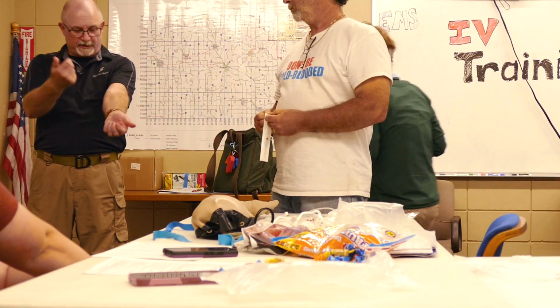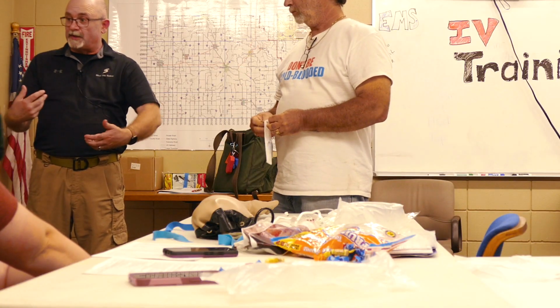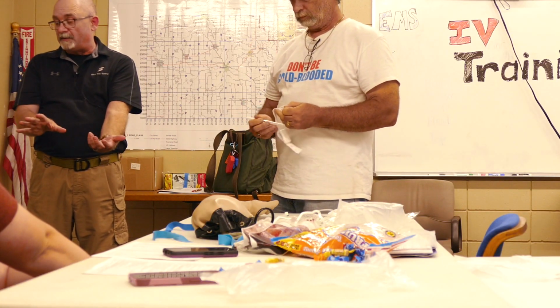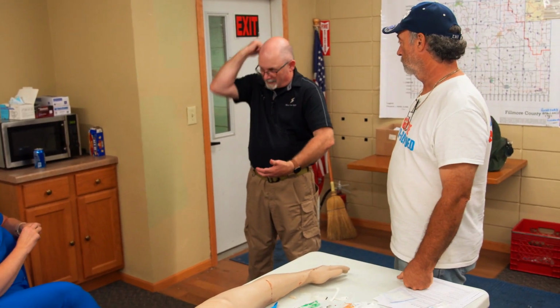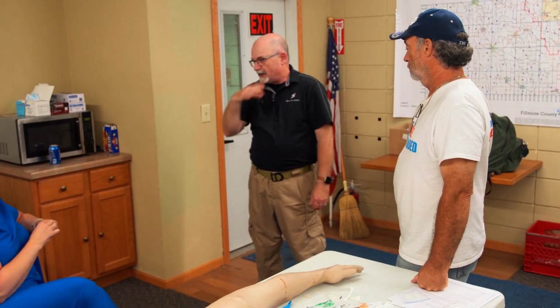Great. So I got my shirt on. Go ahead and start it. If for some reason, great, it's all there, no problem. We get to the hospital and they want to get me into a gown. They just clamp it off and feed it up and then we just take it all off. We don't have to cut. That's normal.